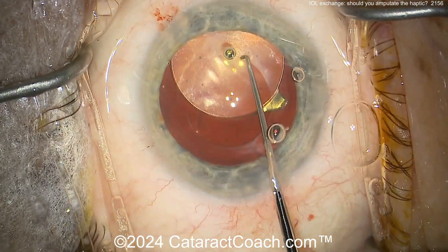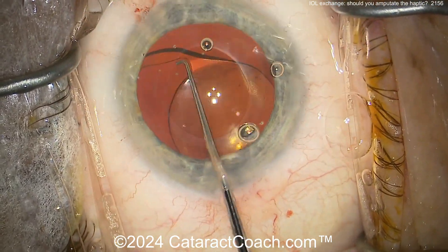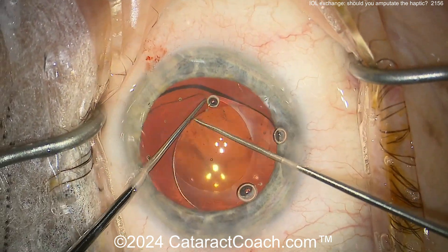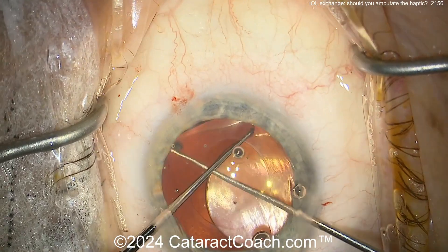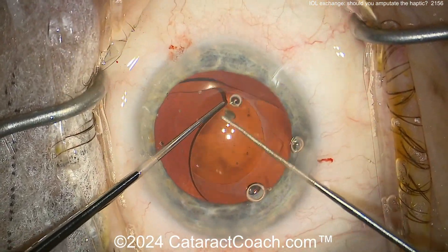In this case the surgeon was able to remove it — I'm watching the video for the first time with you. That would incline me to just try a little bit more to dissect this out. Do a little bit more dissection and see if you can just free it up, because if you got the first one freed up, maybe you'll free up this one too.